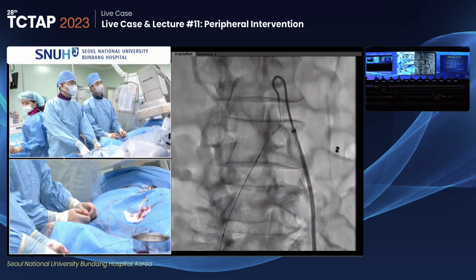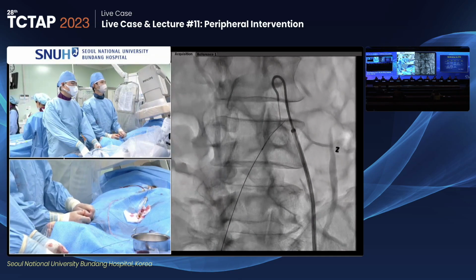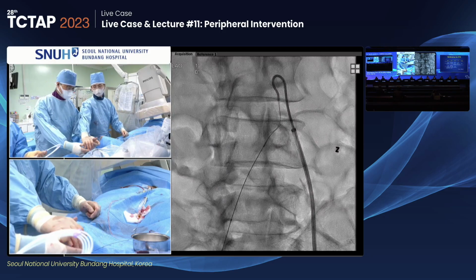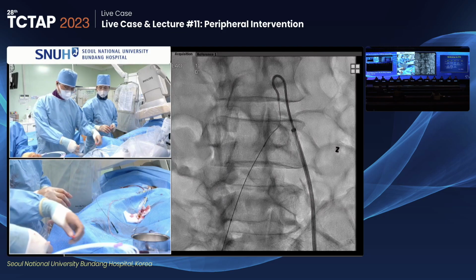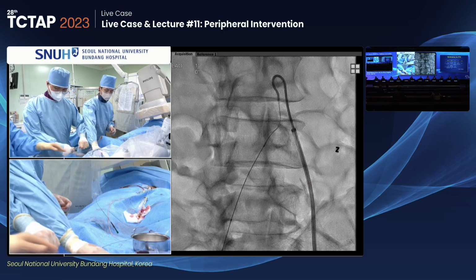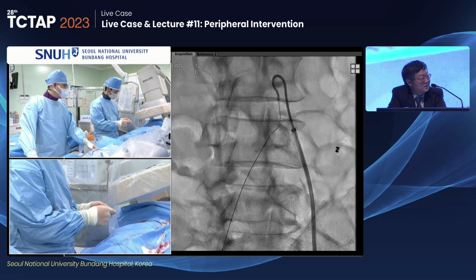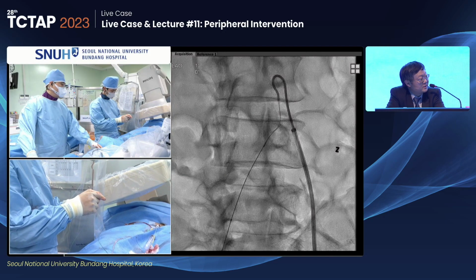So I usually target the proximal wire using multiplanar projection, but this wire is a little bit broken, so it's not easy to navigate the tip exactly. So I changed the wire to the 018 Astato, which has a 30 gram tip load. Because the wire is much closer than a moment ago, I don't know when is the moment we can use a CART or reverse CART, and which one is better.